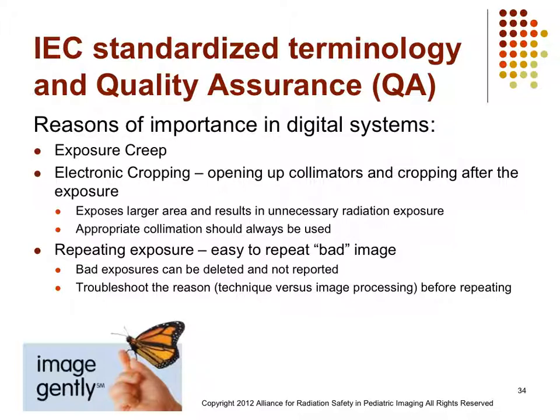That's another 60%. So in essence, we didn't just repeat that exposure once, but by dose, we have now exposed that patient to 3 times as much exposure as necessary. So it's equivalent to 3 exposures because we didn't take the time to actually adjust our techniques. So certainly going to be important. Exposure creep is a phenomenon that we'll really talk quite a bit about.